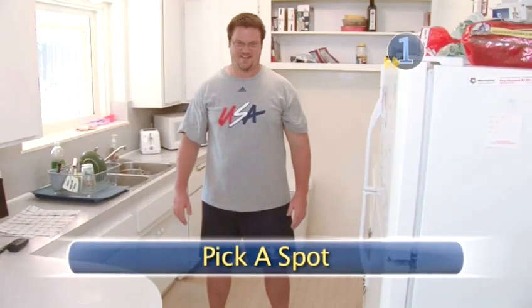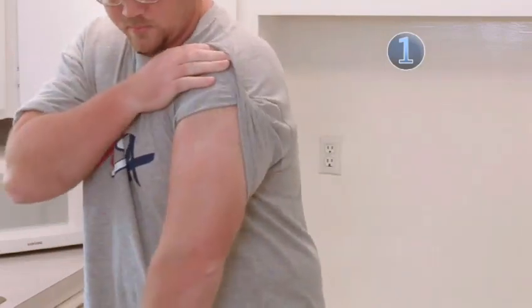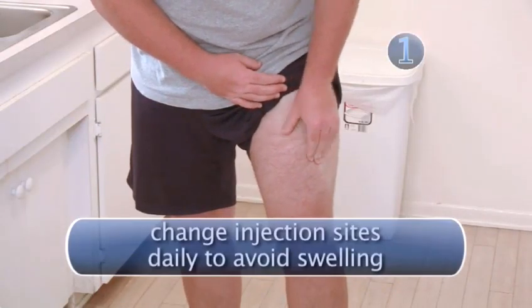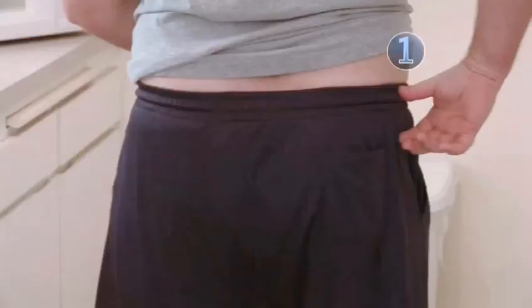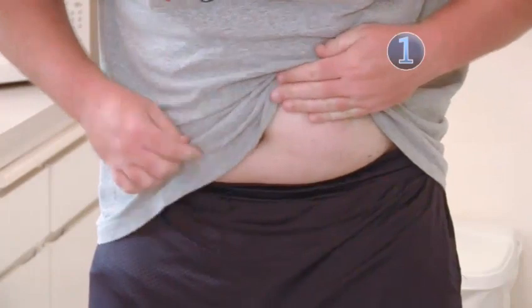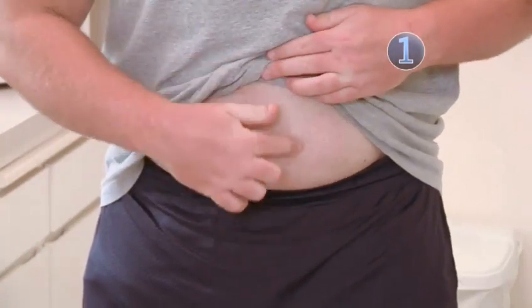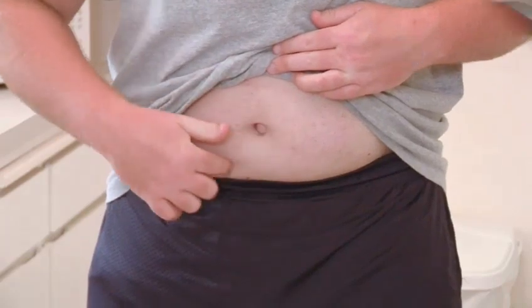Step 1. Pick a spot. There are several body areas where you can give yourself an insulin shot. These include your upper arms, front and sides of both thighs, buttocks or hip area, and abdomen. If you do inject yourself into the abdomen, avoid the 2-inch circle around your navel because that area does not absorb insulin well.